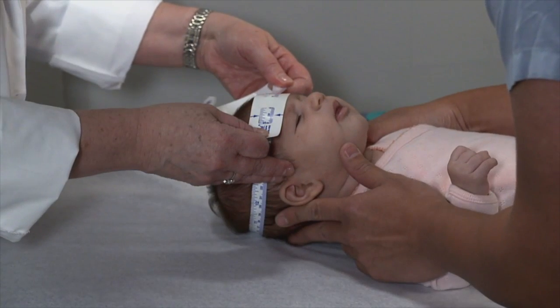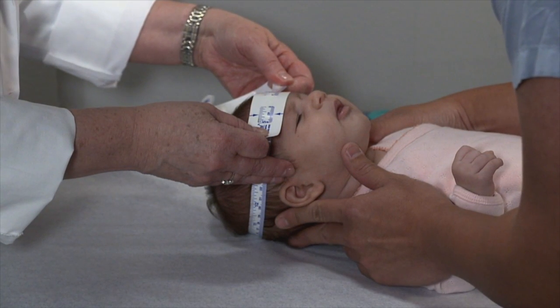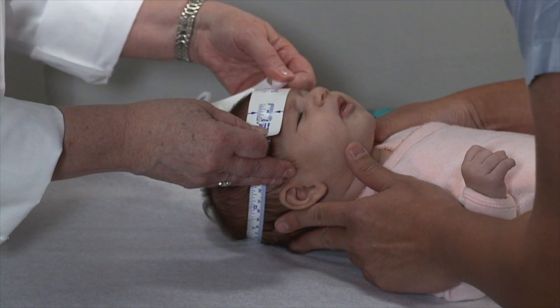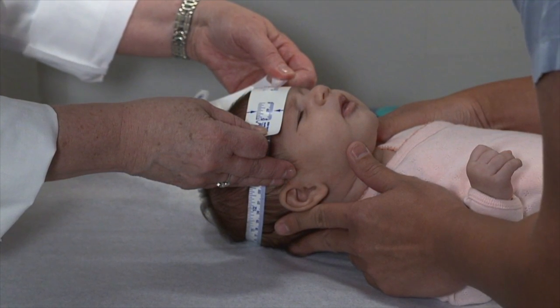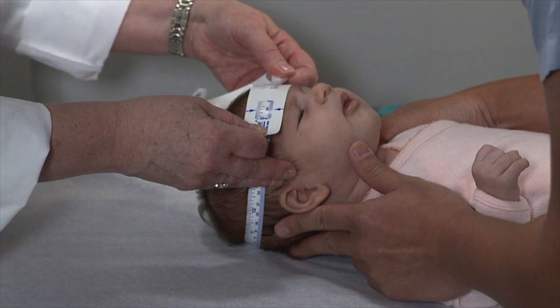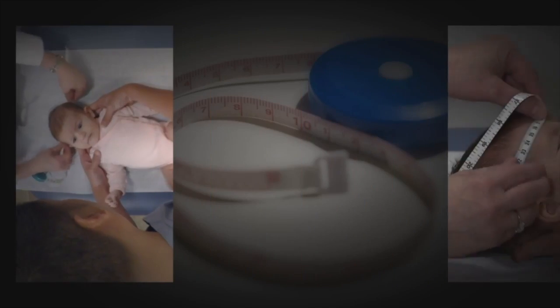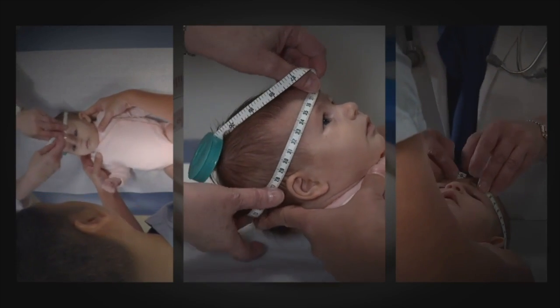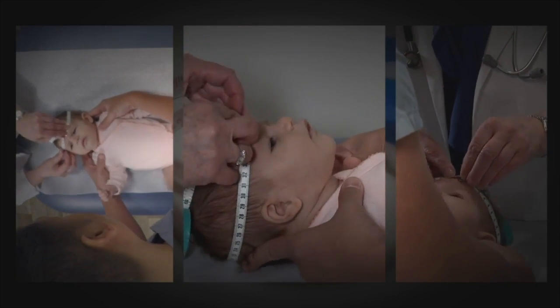That's usually 1 to 2 finger widths above the eyebrow on the forehead, and then across the most prominent part of the back of the head, as you can see here. We recommend that you reposition the tape and repeat the measurements 3 times. Record the largest measurement to the nearest 0.1 centimeters.